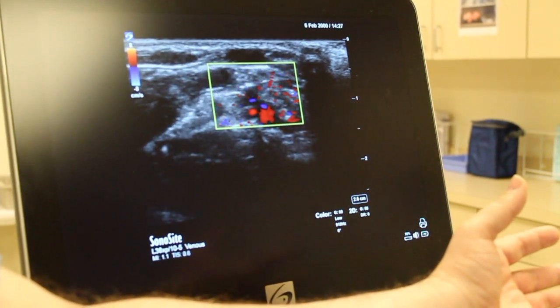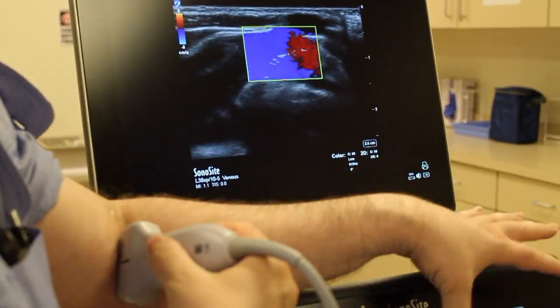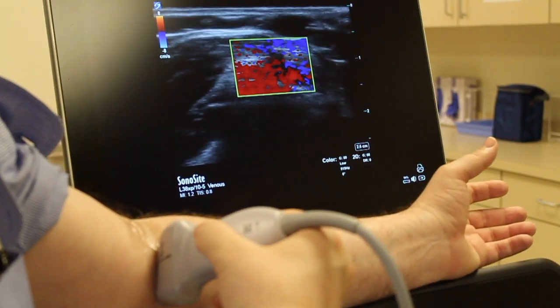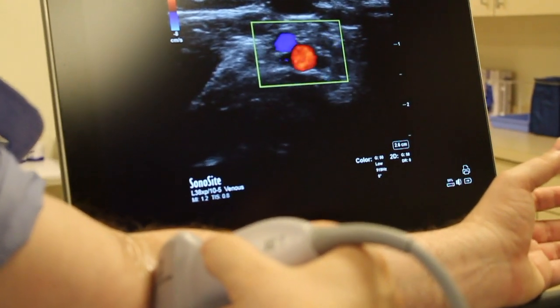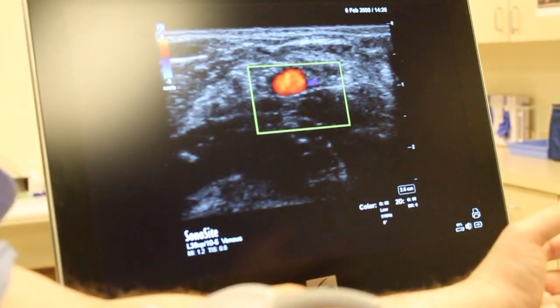Whereas if I look for my brachial artery, which is going to be more medial, I'm going to look for pulsatile flow. And so that's going to be that red right around here — we see pulsatile flow through the artery. And when I compress, the veins shrink and the artery stays open.